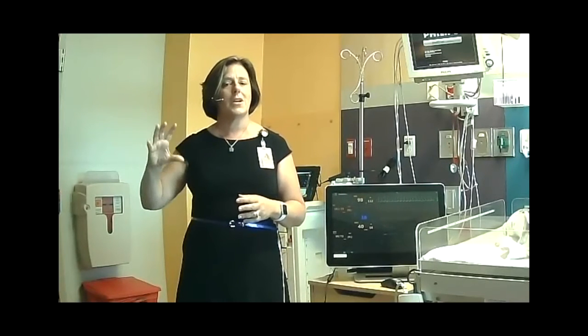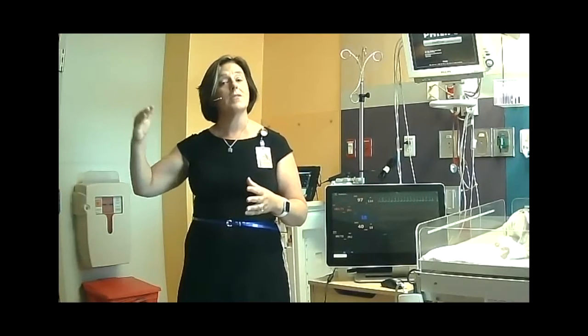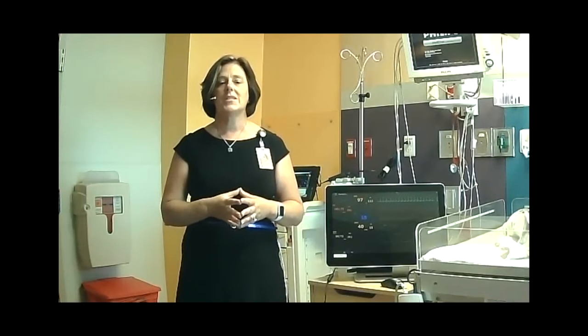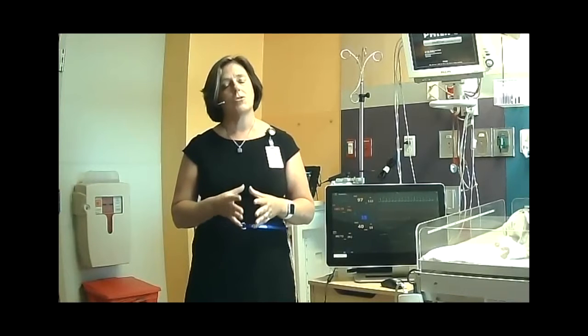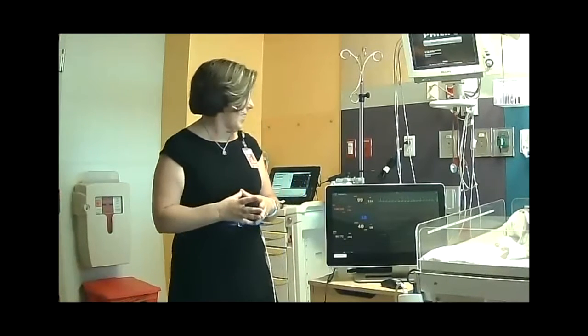And then we also have central areas so that someone doesn't always run to an alarm. Many times it's because it's already converted itself and it's okay, and she was in the middle of something, so she didn't run right then. Other alarms will go to higher and higher levels if somebody needs to answer them right away. So monitors do ring, and it's because we set them up to ring. Sometimes somebody might set the limits real close and you might bounce things a lot. So you have to be very careful with that.